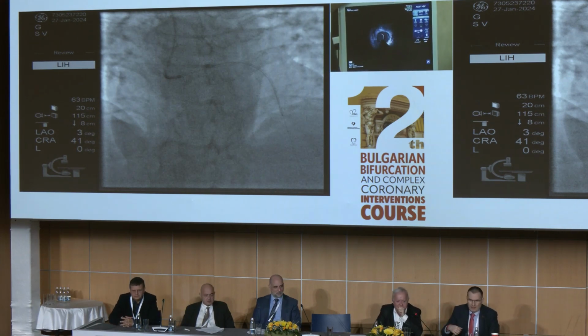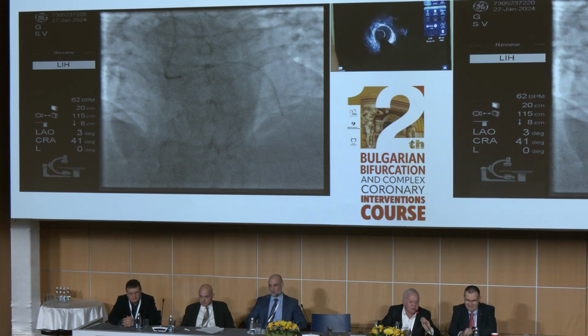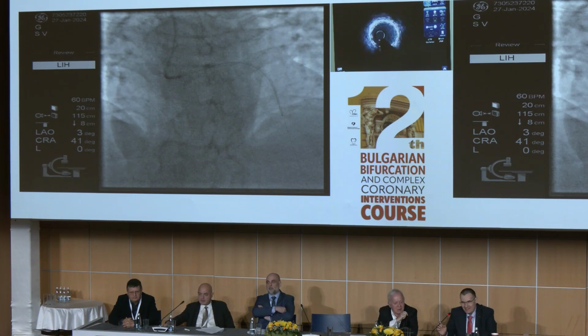You have seen, okay. This is the distal vessel. So you will have to explain what you see because, you know, I'm not a specialist. Is it on the wall or not? Well, this is the distal vessel. We start to see the distal part of the stent. At this point, perfectly opposed. You see that it's almost OCT quality.